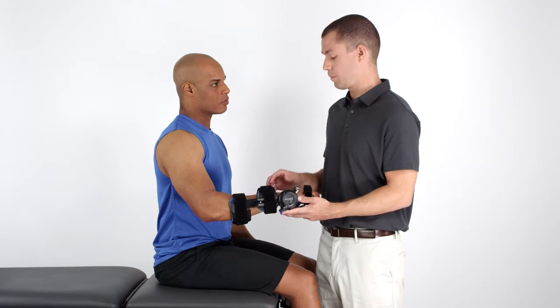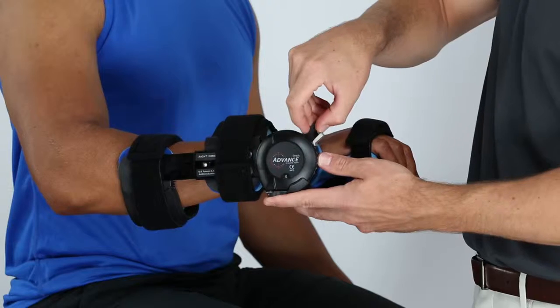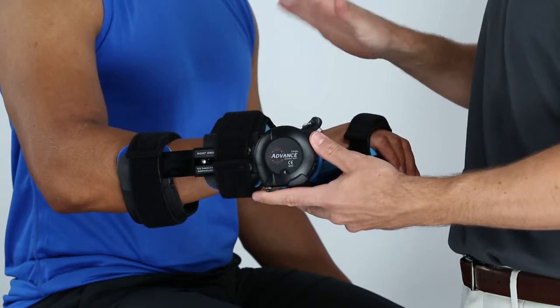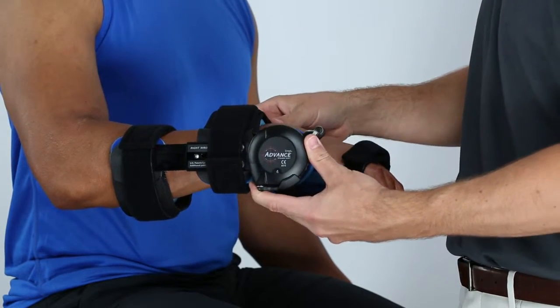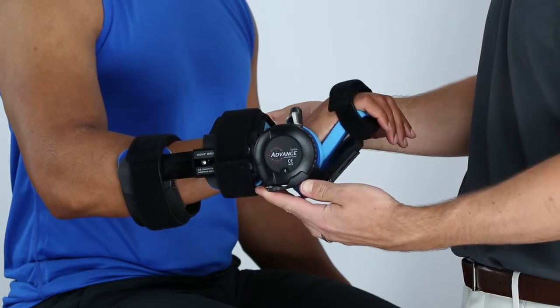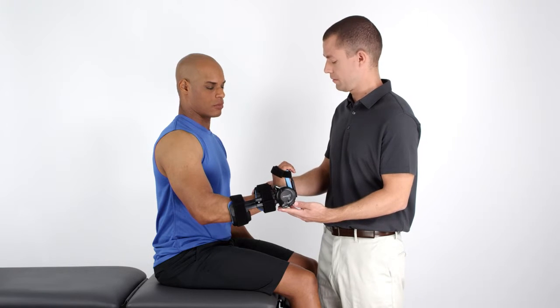With the straps secure, the next step is to place the device into dynamic mode. Disengage the lock lever's safety by swinging it away from the lock lever. Then apply a slight force on the strut to disengage the lock lever. The advanced orthosis now provides a dynamic stress on the wrist.